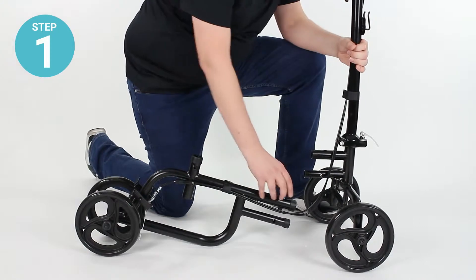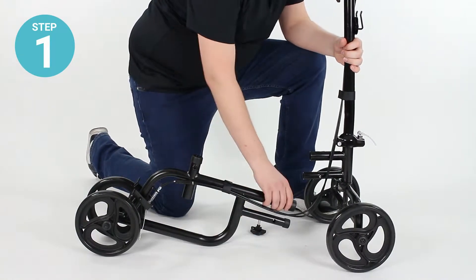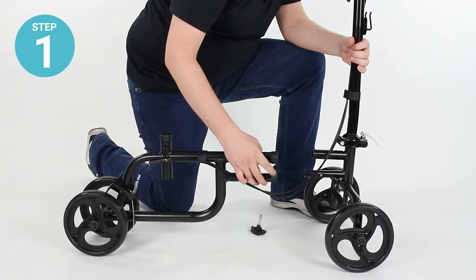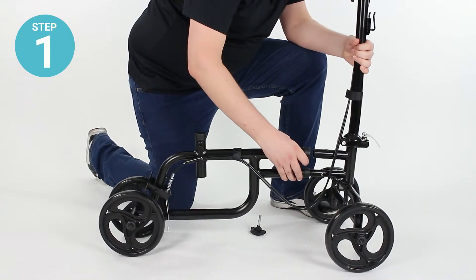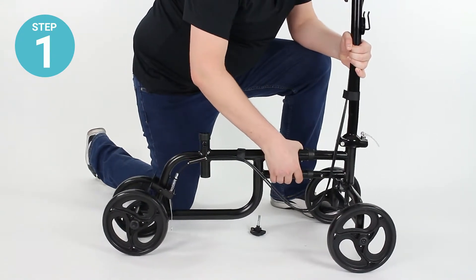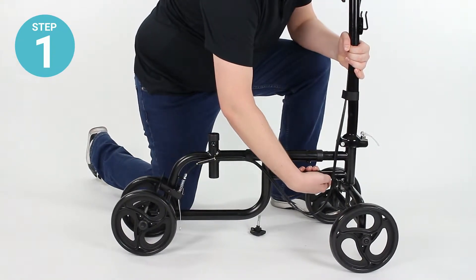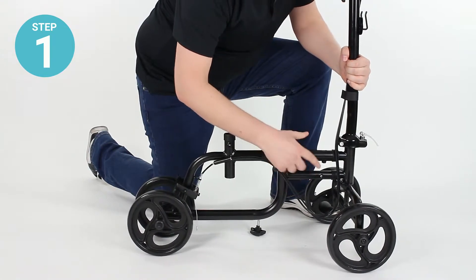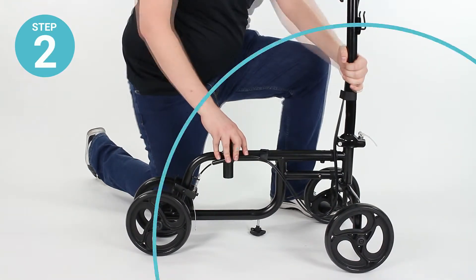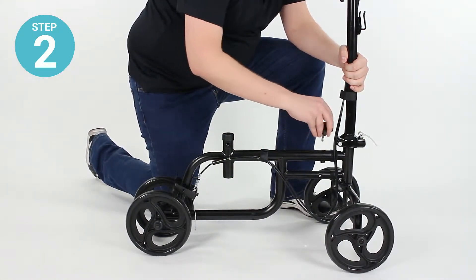Step one: remove the screw knob from the socket on the rear section and fit the two male ends on the front frame section into the two female ends. Pinch the two locking pins together and push the sections together until the locking pins pop into place. Step two: reinsert the screw knob into the socket.